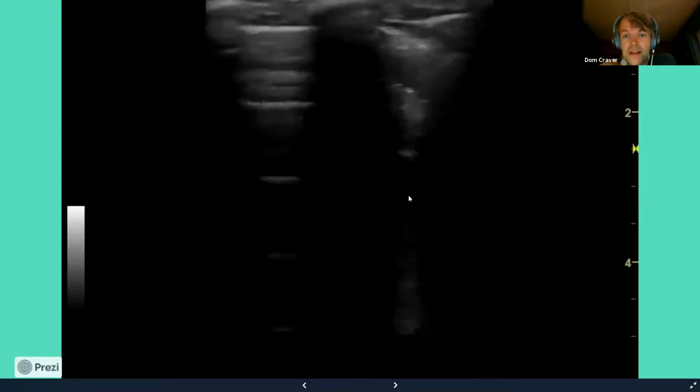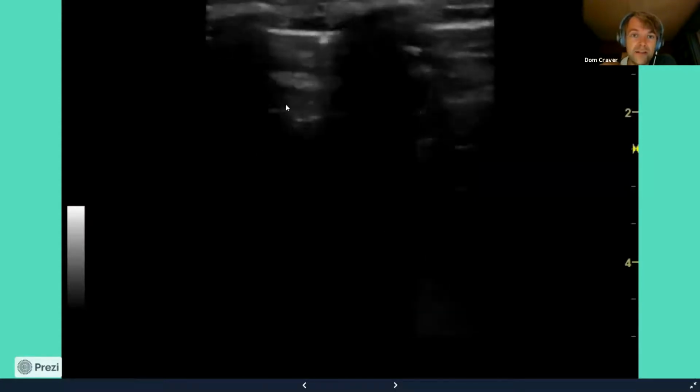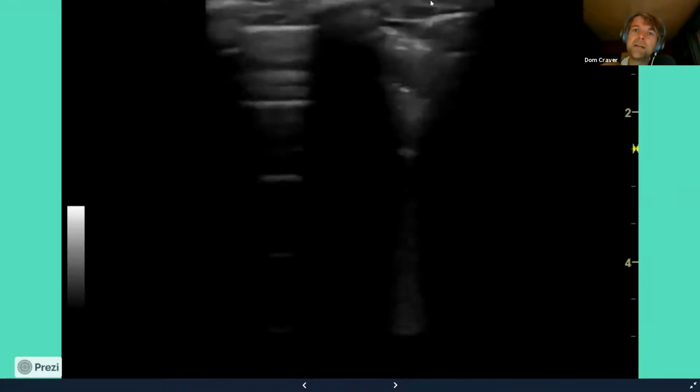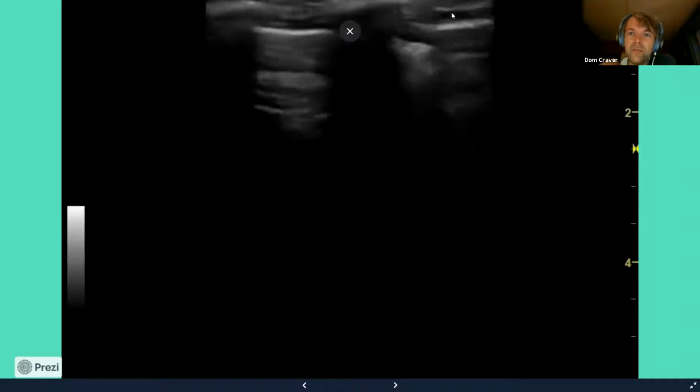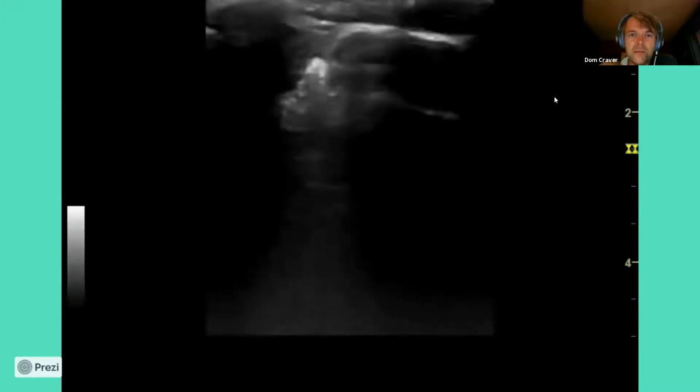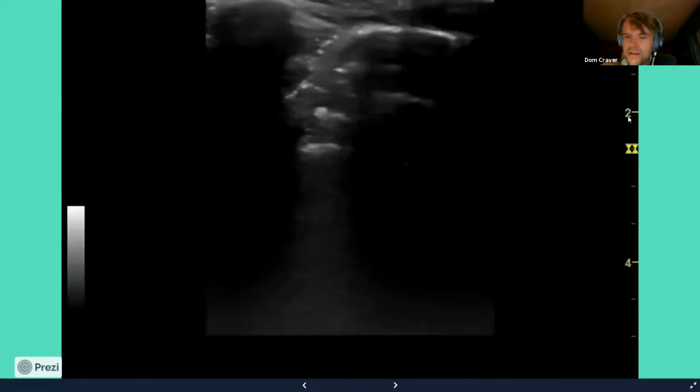So thinking about lung ultrasound, this could well be a pneumonia. You can see it's coming in here, see these B lines coming off. Look at the left side there, you see this normal A profile coming down. We've got these rib shadows, okay? And you can see that the footprint is nice and straight, so that's the linear probe that we're using. And again, one more image, so load up, there we go. I think that's the same one actually.